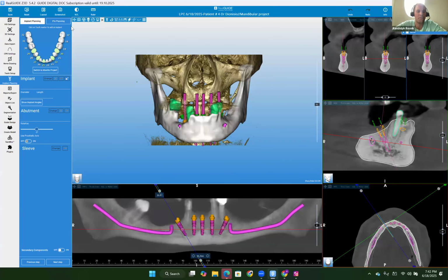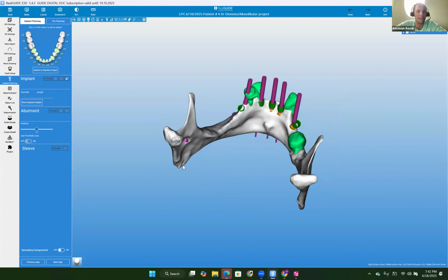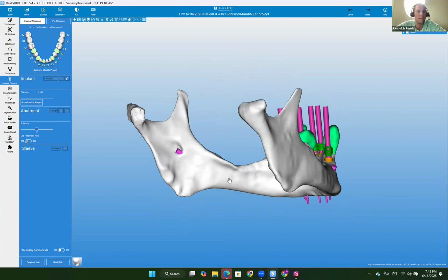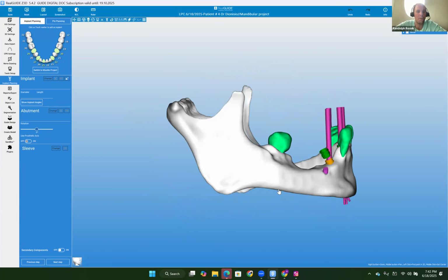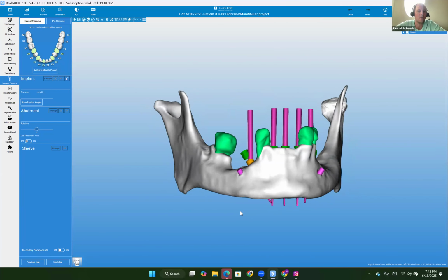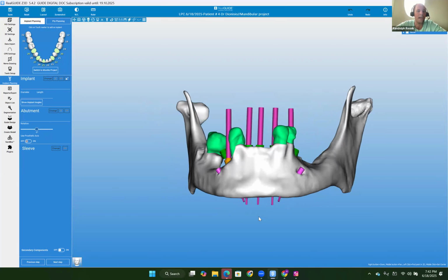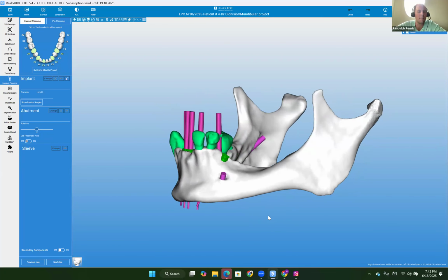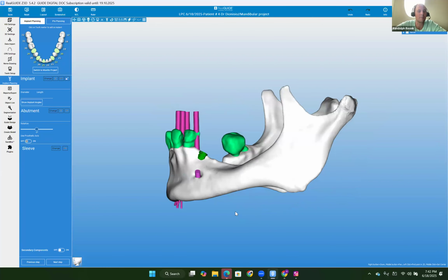So it's going to be the same in terms of the restorative, where we need to reestablish it. Now, with the mandibular anterior here, you're going to have to do plasty to get the necessary width. So we're going to gain a pretty significant amount of restorative space just from doing that. But still, based on your exocad plan, we'll make sure that we have them in the correct position. So it'll be similar in terms of that.